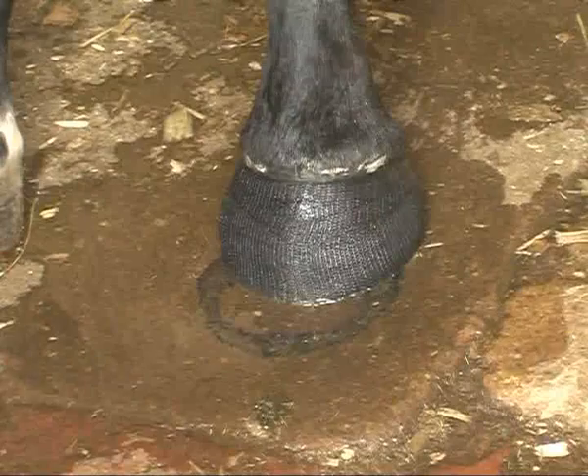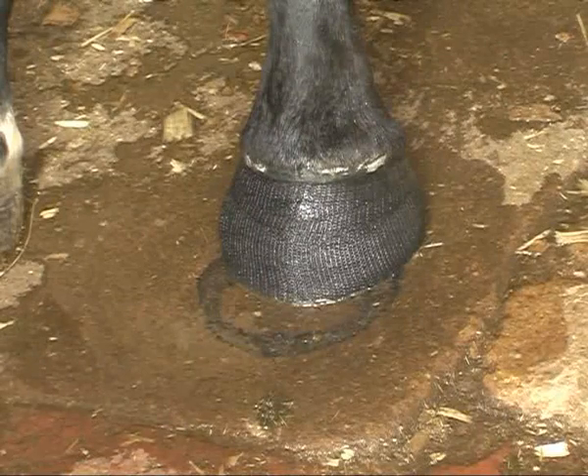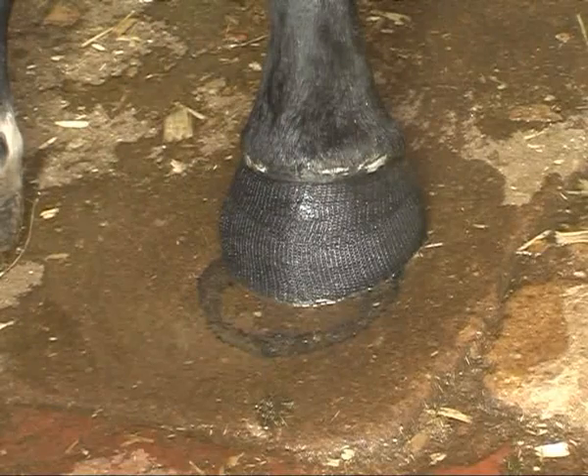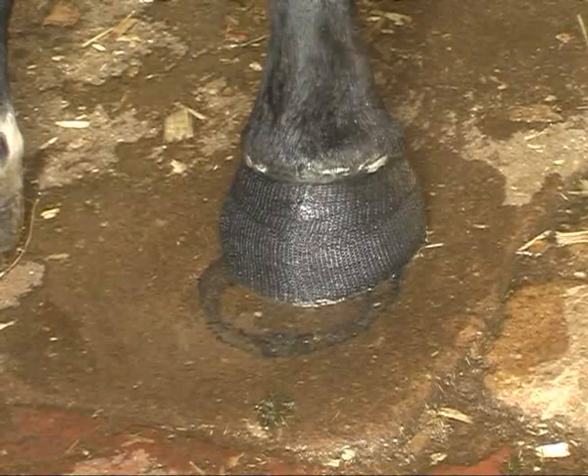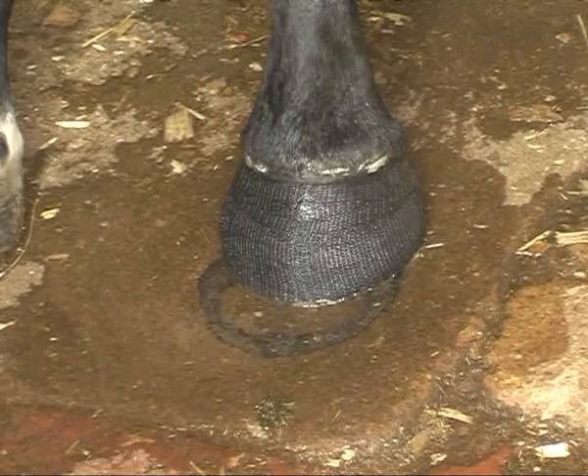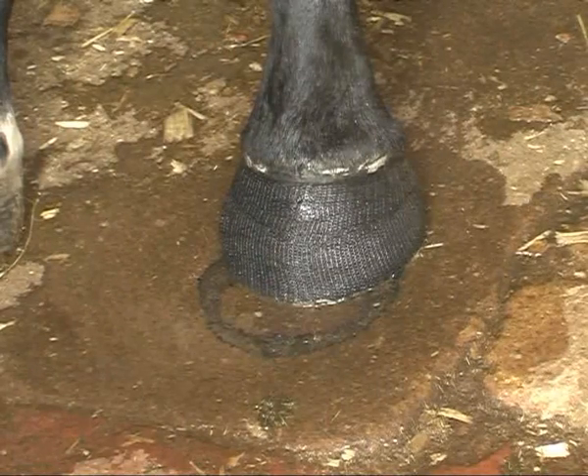I've been looking for something like this for 40 years. I'm now fortunately in a position where I never have to go into a yard and say, 'Sorry sir, I can't shoe your horse — leave it in the box for six weeks and it'll grow enough foot for me to be able to put a shoe on.'